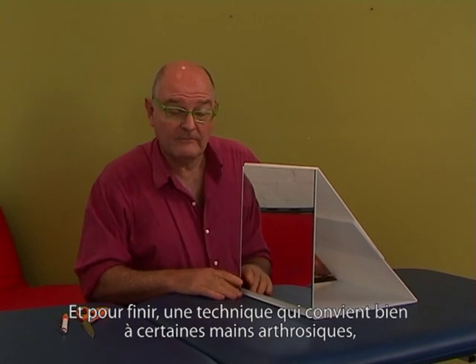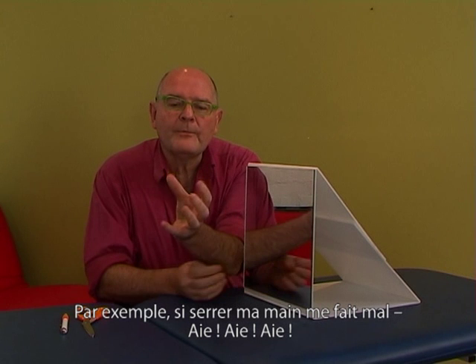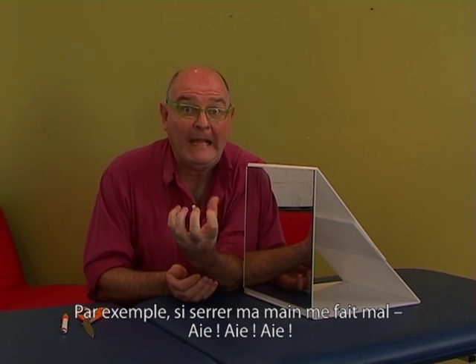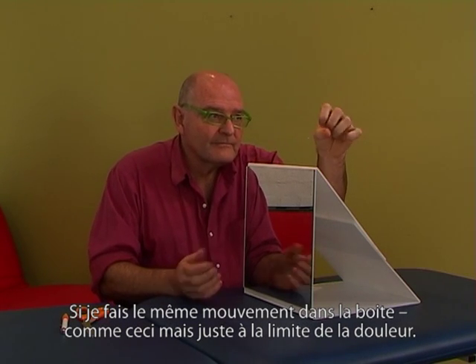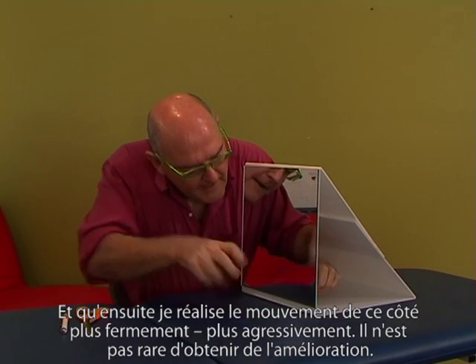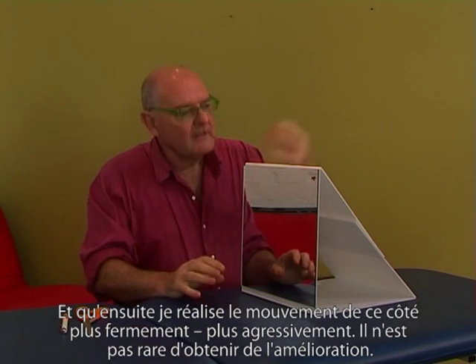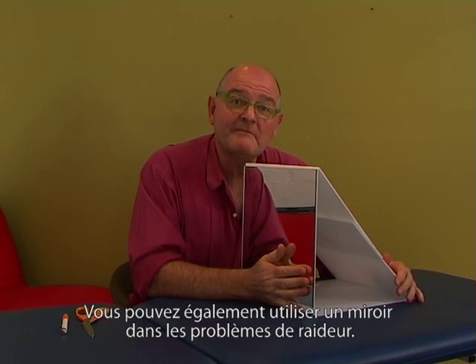that's also useful, and quite useful for some of the arthritic hands. For example, if squeezing my hand hurt, ow, ow, ow, if I did that same movement in the box, like that, same movement in the box, but maybe just short of hurting it, and then I did the movement here more aggressively, this will usually improve. You can also use a mirror for stiffness.